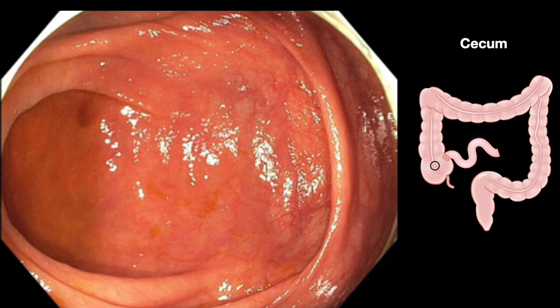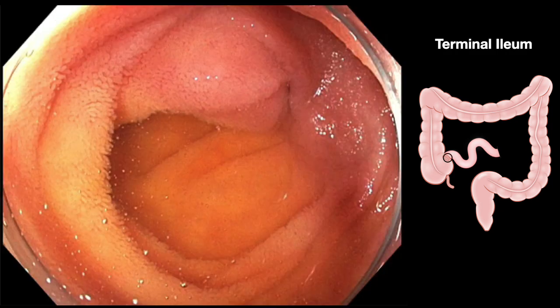And when you are in doubt, you should always make sure that you check whether you can see the villi of the terminal ileum by intubating the ileum. So here you see the villi, and when you see the villi, you know that you have reached the terminal ileum that is close to the cecum, and you can be sure that you have reached the cecum.